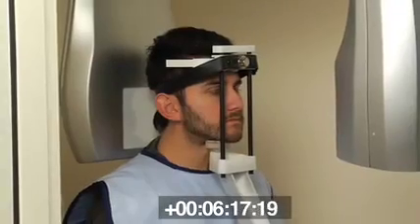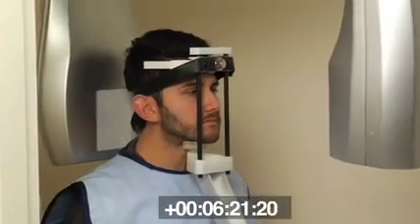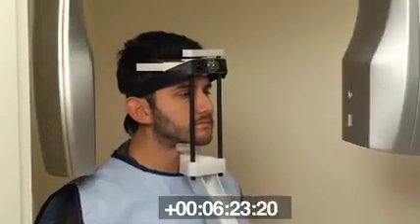And so we're going to push this button that shows what's going on, and what we're going to do is pause for a second here so we can reposition the camera, and we'll show Vince in living color here. So now we're going to actually ask the computer to perform the scan, and we'll ask the patient not to swallow. Hold still, it'll rotate around the head.